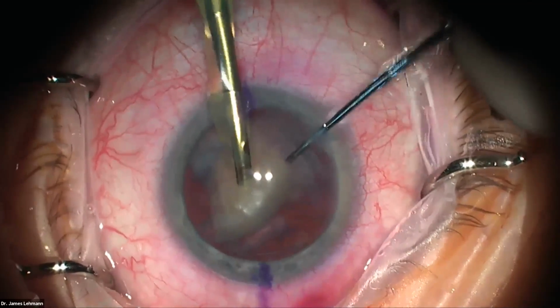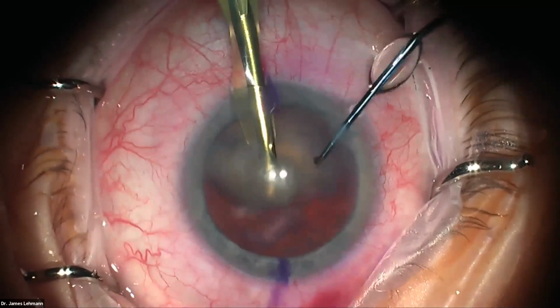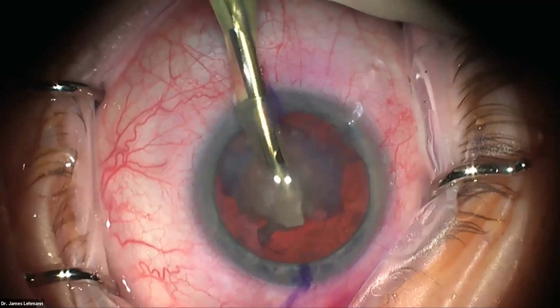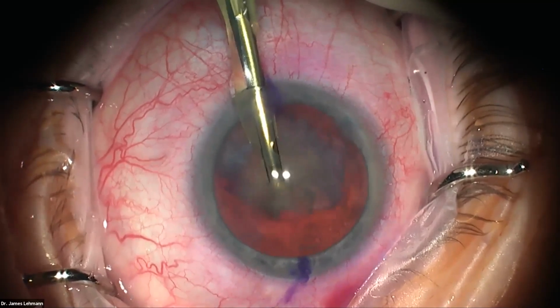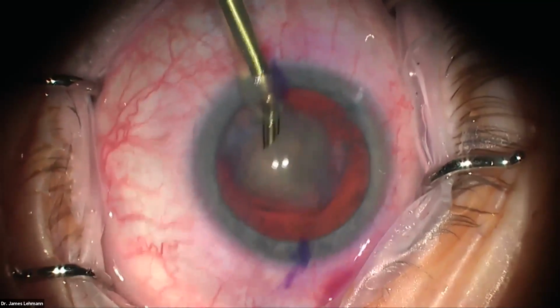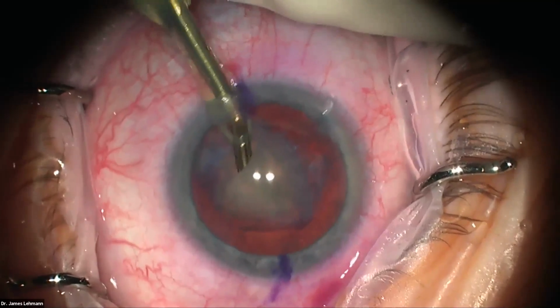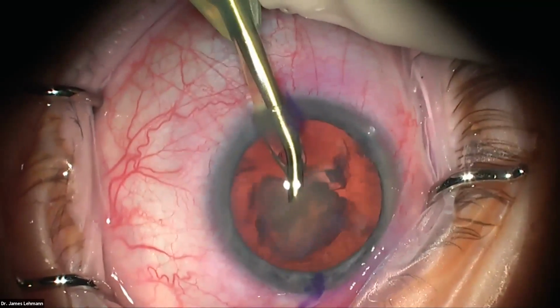Now it's attached in the middle there. That's okay. And then we're just going to be patient. I'm going to remove my second instrument. I'm phacoing in the AC now more, eating that last piece. Wait, excuse me, the third piece. And now I'm going to rotate my phaco tip and engage that corner of the lens right there. And now we're in the AC.